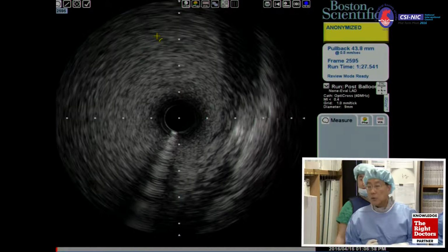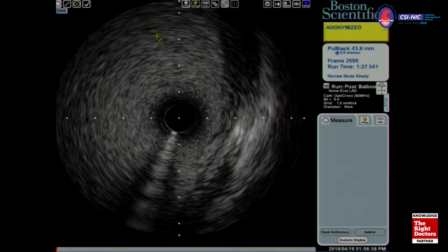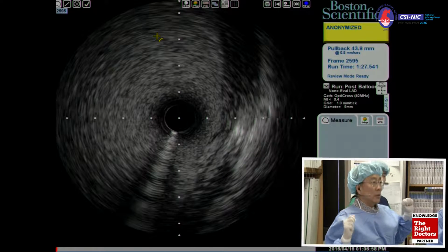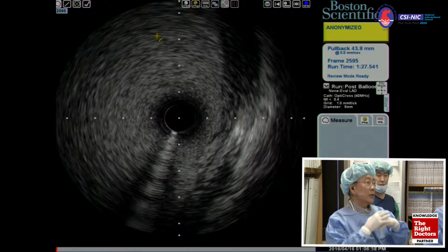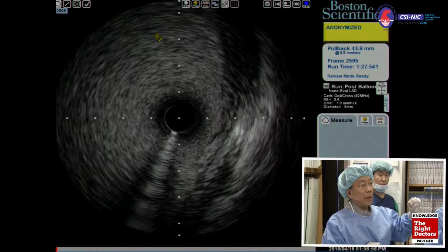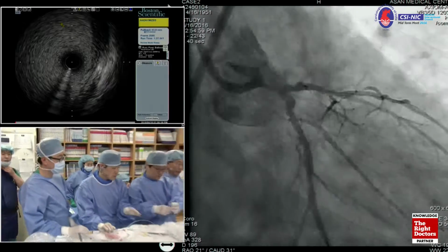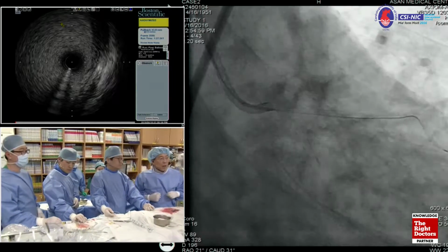Okay, so the issue is actually very diffuse disease. Significant disease from the LAD to the main, no doubt about that one, right? Ostial part of circumflex. If you look at the angle relations between the LAD and circumflex, there is some disease on the circumflex ostial part. Why not? We're gonna try the two-stent, right? Yes. Two-stent technique from the beginning, especially for the main disease.